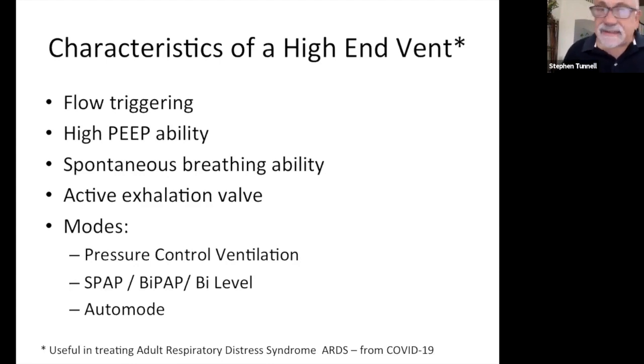But it's an excellent, insightful question, because PEEP can cause a person not to be able to fully exhale when used in a therapeutic approach of excessive PEEP to keep the lung completely inflated at a high oxygen level.